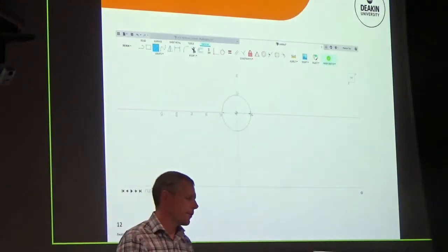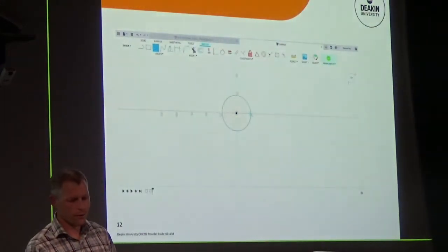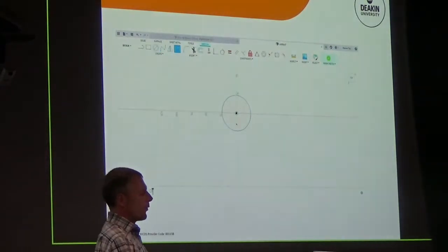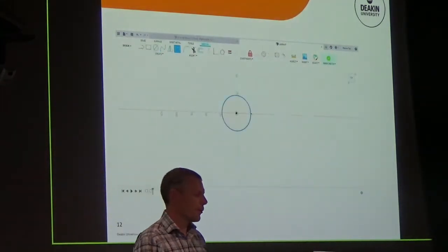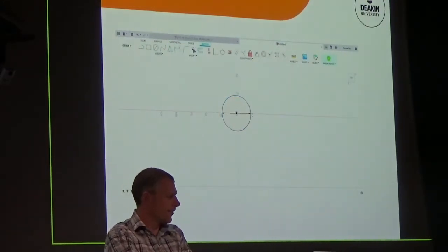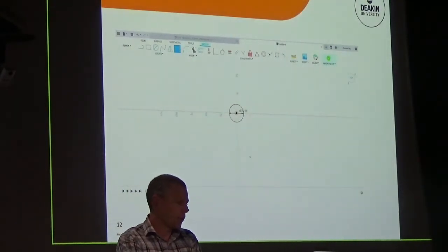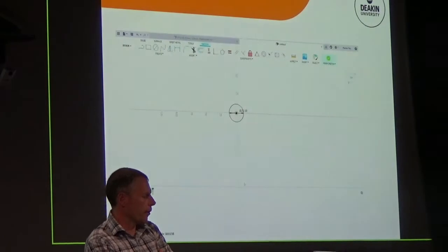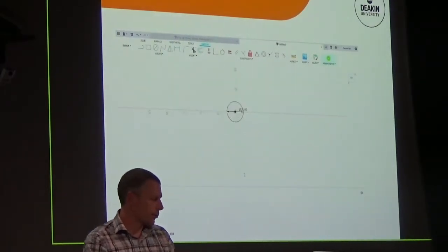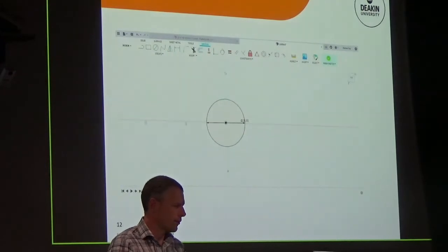And basically this is me drawing circles, very interesting, and changing circles, even more interesting, but on some fancy computer. So basically I drew a circle, I was pretty good at kinder, so I stuck to it. So now I'm just manipulating the size of it. This is all in millimetres, so I've just modified that to 20, or 25 mil, and then because I thought I was quite good at drawing a circle, I thought, why not draw another circle?